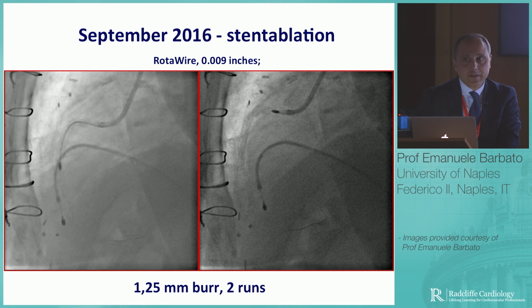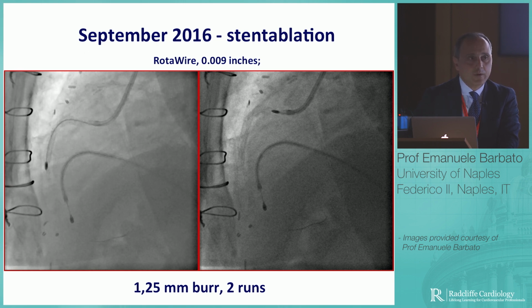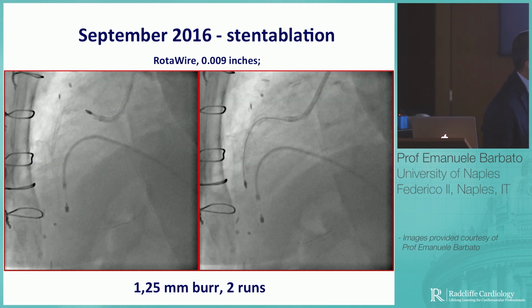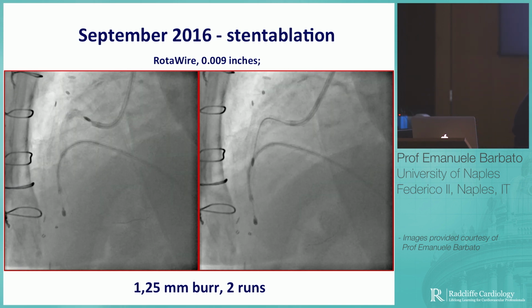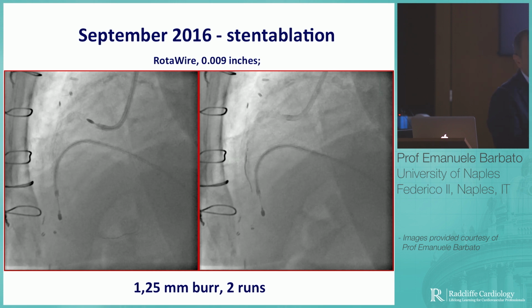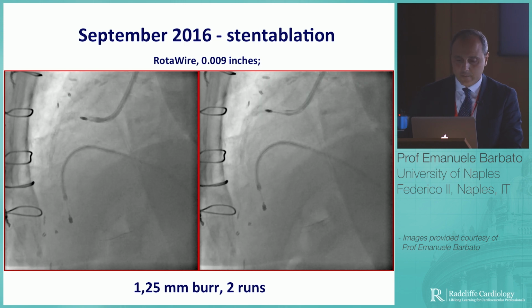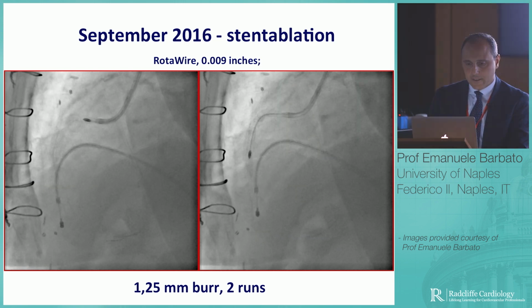We paid a lot of respect to this segment because the last thing we wanted was that the burr would get stuck in it. And in fact, if you notice at the very end, the burr crosses, but it entraps there, and without stopping spinning, it was forcefully pulled back, and in this way, we got out of trouble.